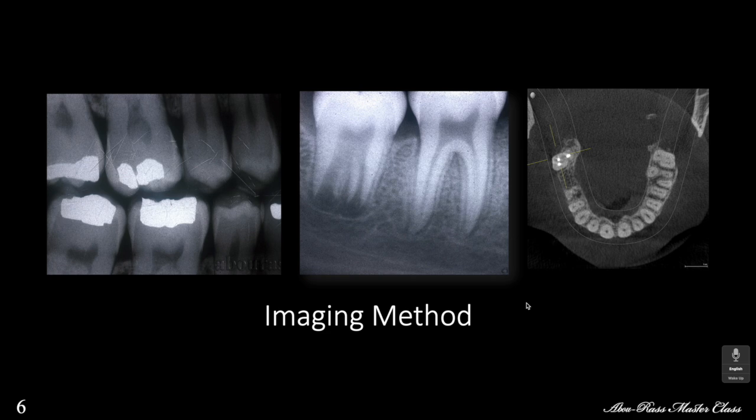of interest. What affects our interpretation of the radiograph and extrapolation of the diagnosis or the pathology condition is first the imaging method. The imaging method here, I am very biased that for pulp chamber, restorative, endodontic, periodontics, it has to be the PA and the bite wing. Nothing else.